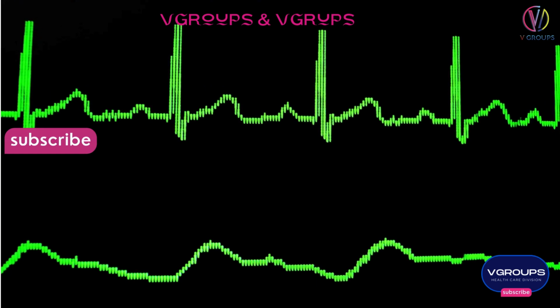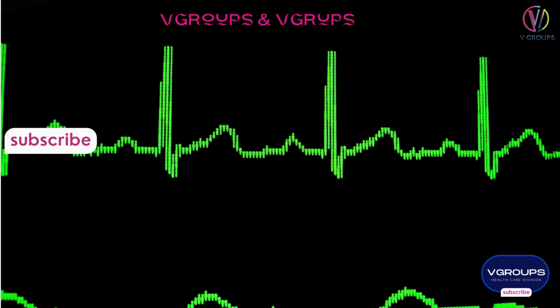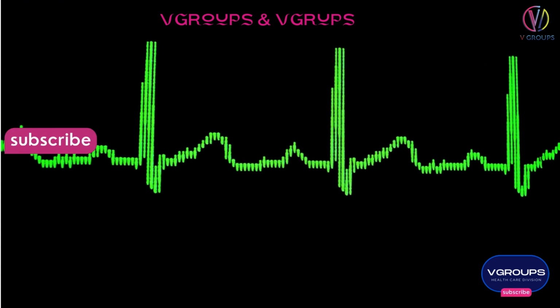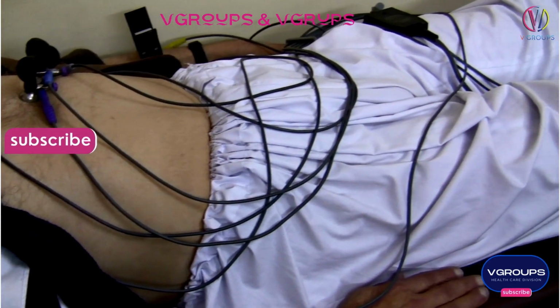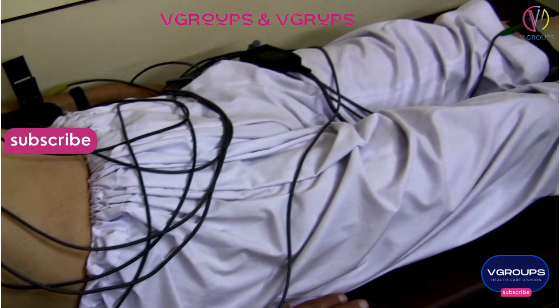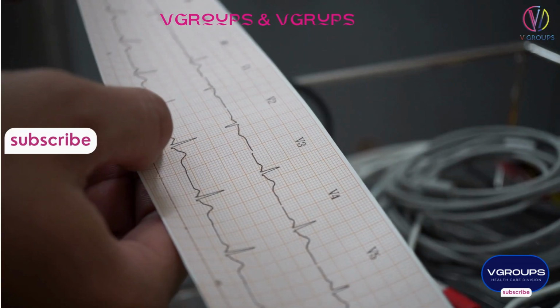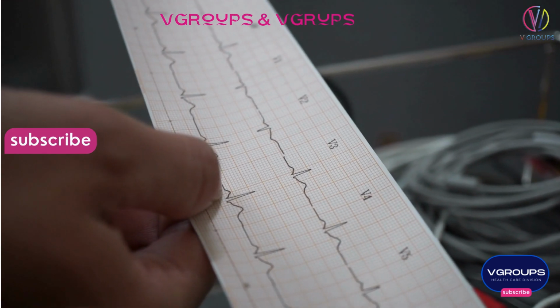Signal display. The processed signals are then displayed on a monitor or printed on paper as a series of waveforms. Lead configuration. ECG machines can record the electrical activity from different perspectives, known as leads. The most common lead configuration is the 12-lead ECG, which provides a comprehensive view of the heart's electrical activity.